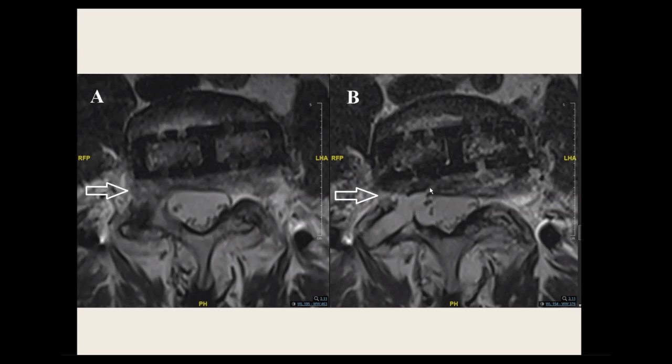So I think the safest thing to do is complete your surgery safely, and then, I've used cases where I put in a piece of Duraform collagen matrix, fibrin glue, or nothing at all, and it usually seals on its own. I think it's really important to note that CSF leaks, dural tears, are a completely different animal in endoscopic spine surgery. Typically, they happen on the ventral surface rather than the dorsal surface. This is sort of ventrolateral, but the point being is there's not a whole lot of dead space for a pseudomeningocele to form, and it's just a very different animal than an open surgery.